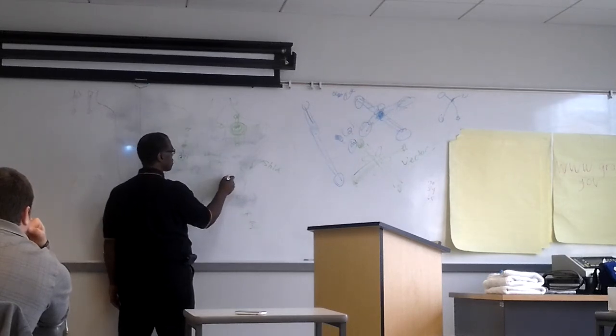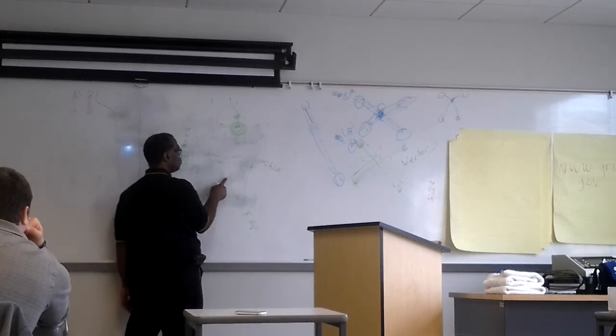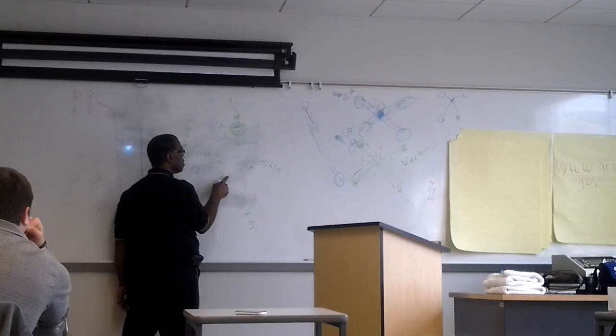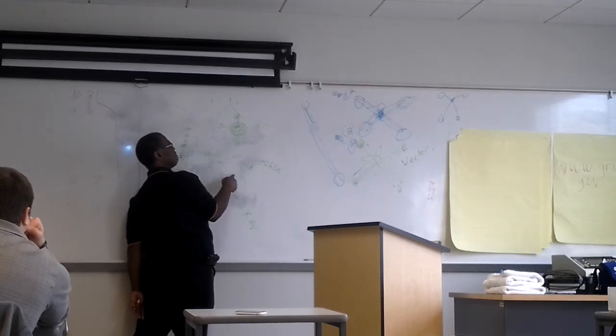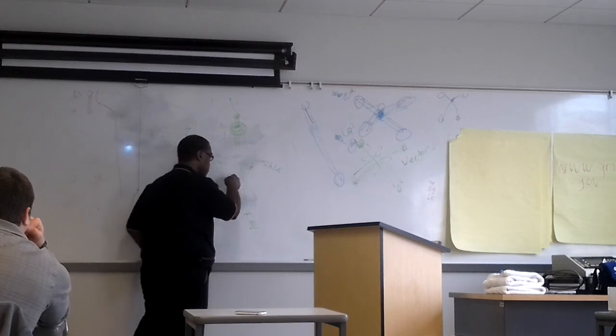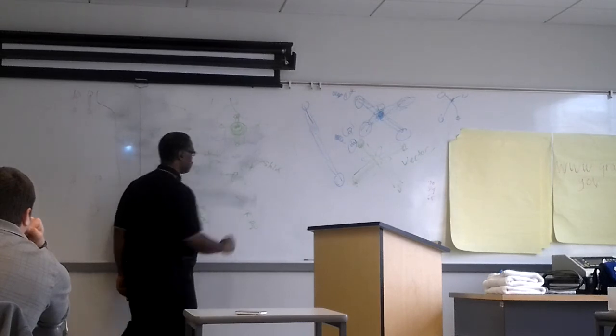And you'll see the little vector on the screen. And you'll put your finger on the screen over there, and you'll move the vector current as a representation underneath their skin. Move it around and say, let me know if I'm really getting a spot. No. Oh, that's the spot right there. Oh, that's the spot right there. Well, if you want the vector to stay, you press start, and then the vector will sit right there at that spot.